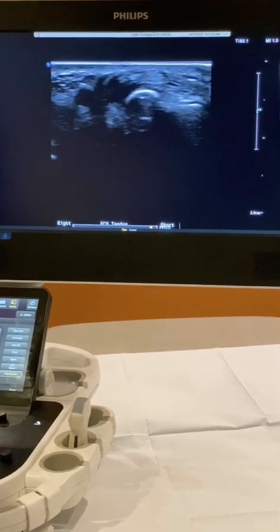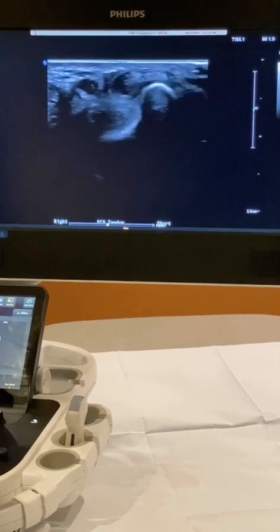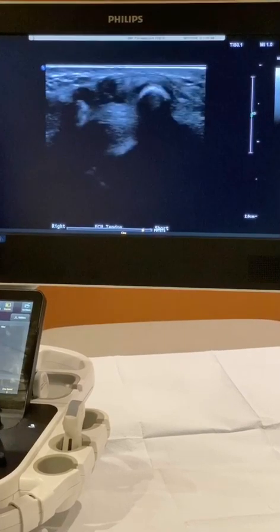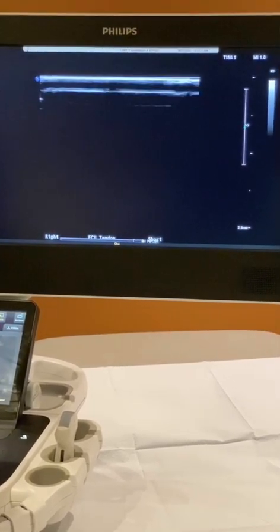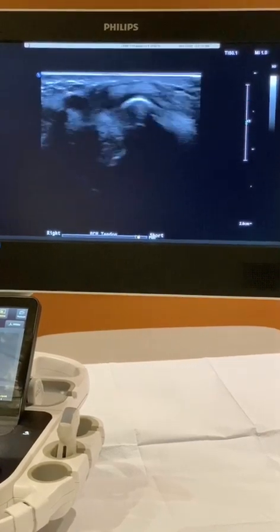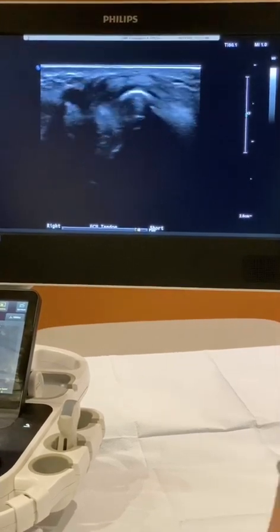If you go back, you can trim your Cine Loop to begin it right before the tendon went over the ulna. You can show it for the radiologist and then clip the end of it where you demonstrated the dislocation. Then you can play your Cine and show where it dislocates — providing a good representation for the radiologist.